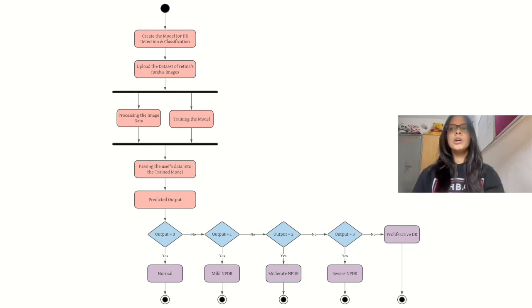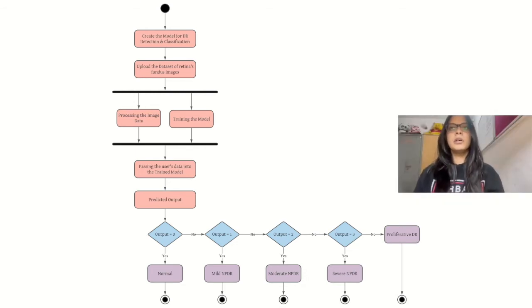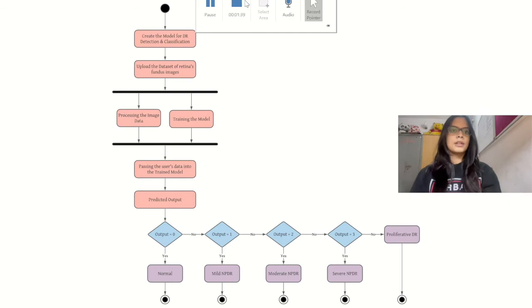So this is how we're able to process the retina images of the person that's logging on to our website and give them a comprehensive solution as to which stage of DR it is and whether DR itself exists or not. Thank you.